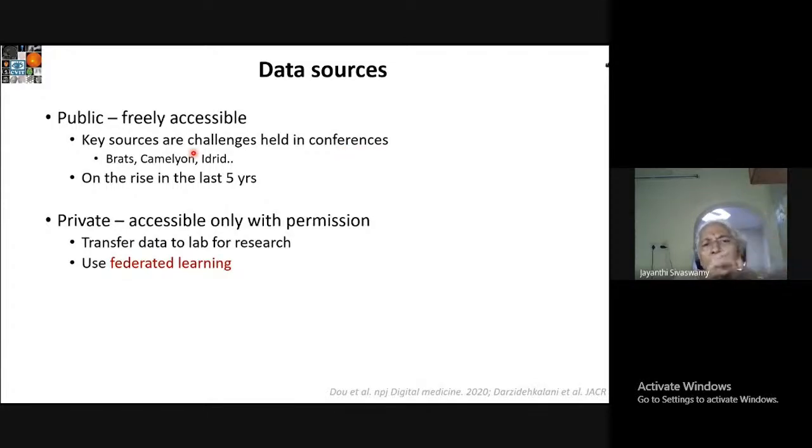So you just Google and say grand challenge, and you will see pages and pages of tasks, which are basically different medical image analysis challenges. BRATS is for the brain, this is for pathology, this is an Indian challenge that was run for diabetic retinopathy from the fundus image and so on and so forth. So typically an Indian student relies on this source.